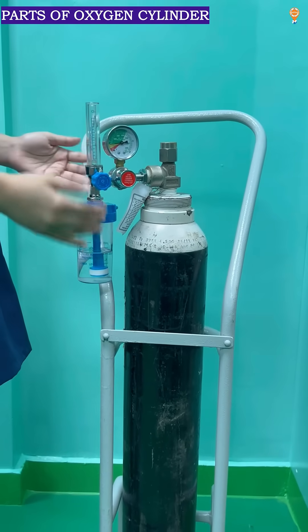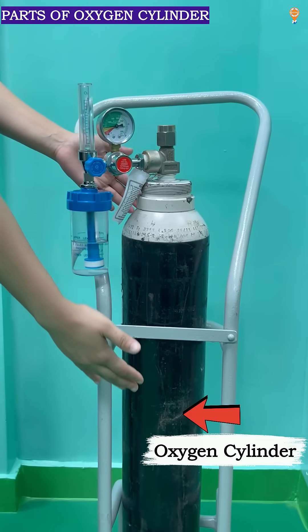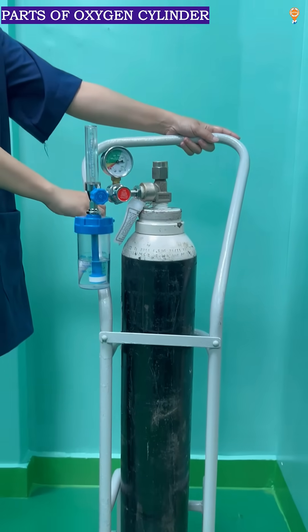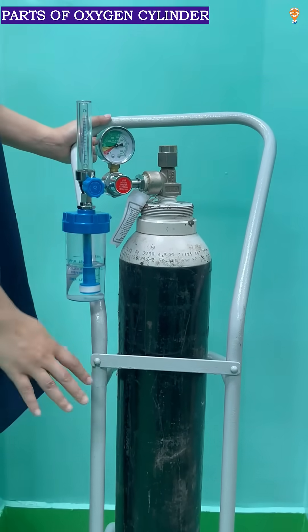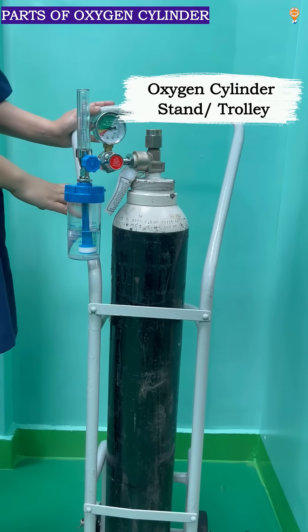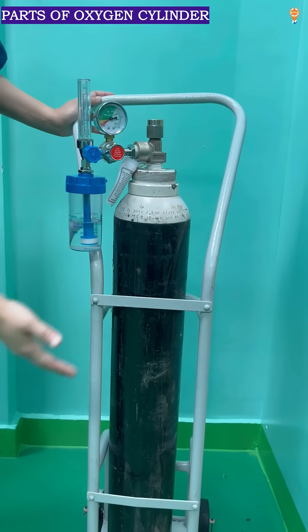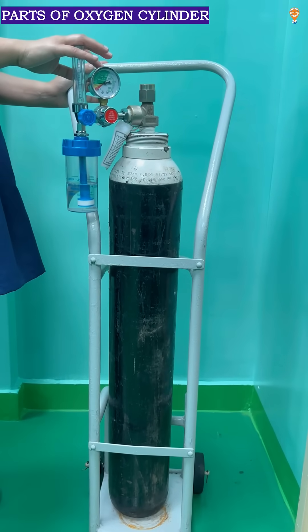This all system is connected to what is called an oxygen cylinder. And this white color that you are seeing is called the oxygen cylinder stand, which is used for easily mobilizing the oxygen cylinder in case of any need. So that is what is the oxygen cylinder and the parts that are connected to it.